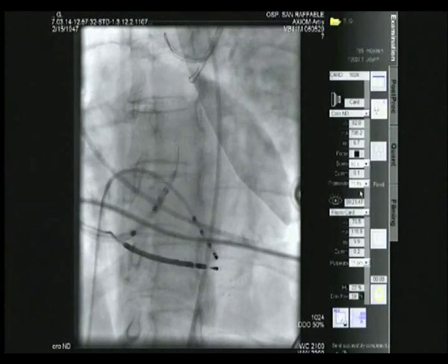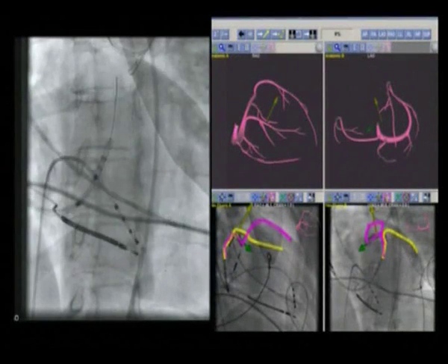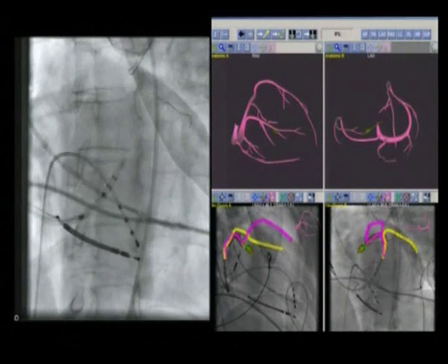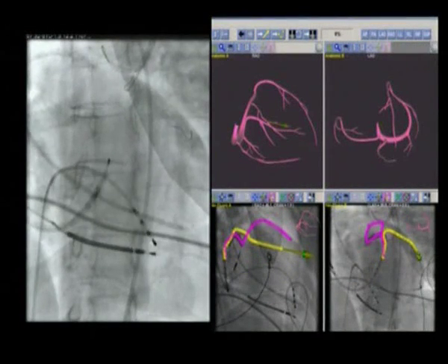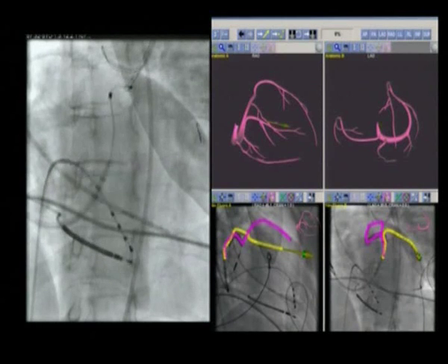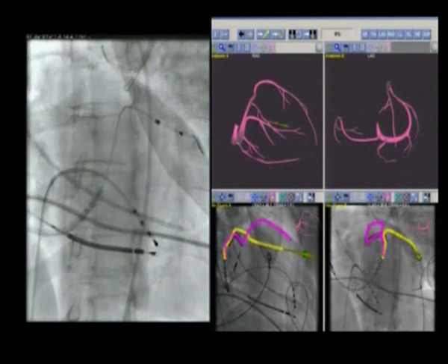Once the lead is inside the first targeted vein — the lateral branch — the magnetic field interacts with the tiny magnet on the guide wire and deflects it, allowing the wire to overcome difficult vein takeoff and tortuous branch veins. As you can see, the wire can be directed at any angle and continuously turned for multiple sharp bends in the vein.